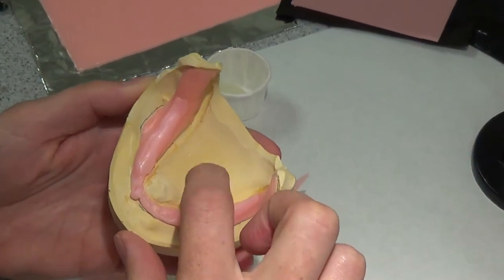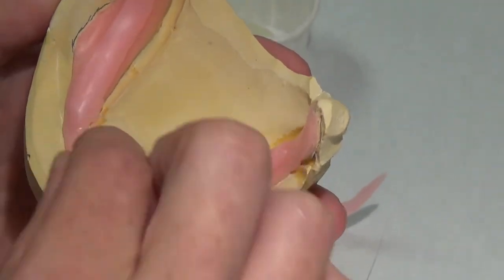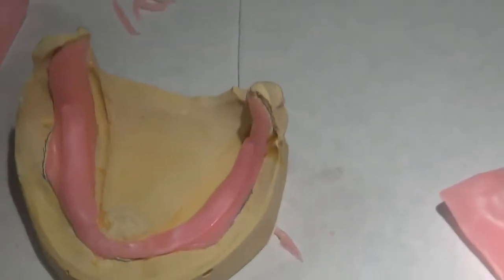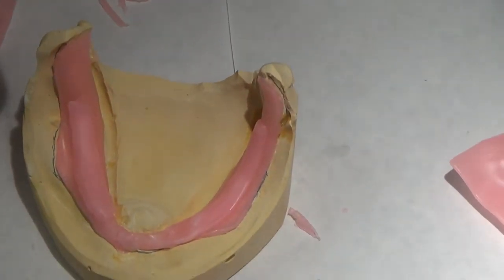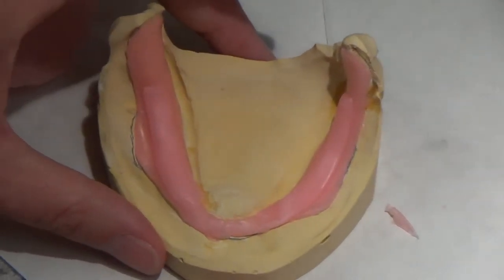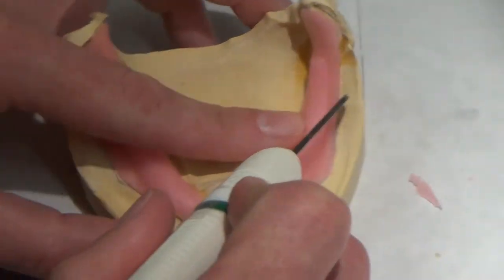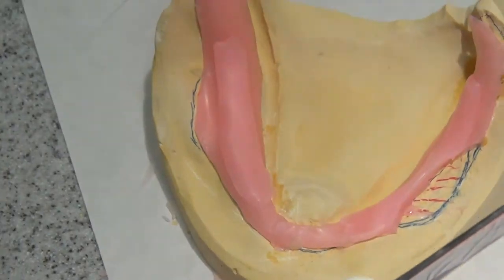My anatomy isn't as smooth here as it is when it's all one piece, but I have the relief that I want and it's pretty even from side to side. So I'm going to cut out my buccal shelf areas. It's really good to turn your hand torches off — just close them up — because you will burn through a lot of alcohol, and when you come in on the weekend and the alcohol is empty, you're going to wish you had some.